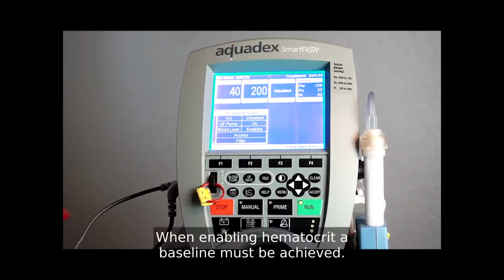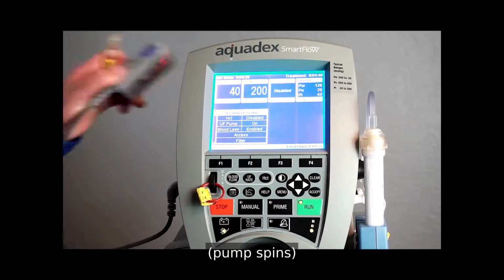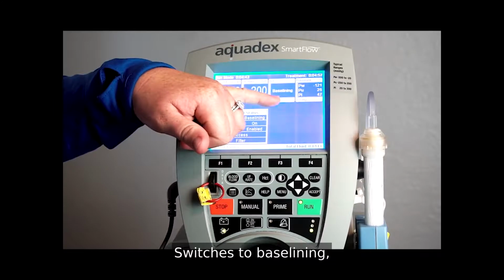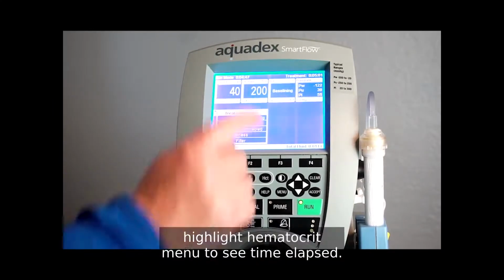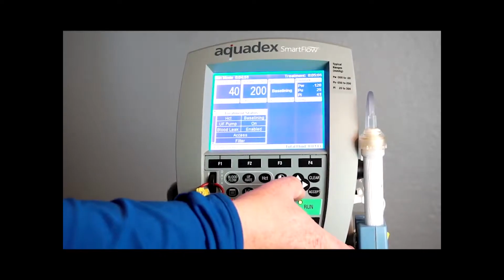When enabling hematocrit, a baseline must be achieved. Switches to baselining. Highlight hematocrit menu to see time elapsed.